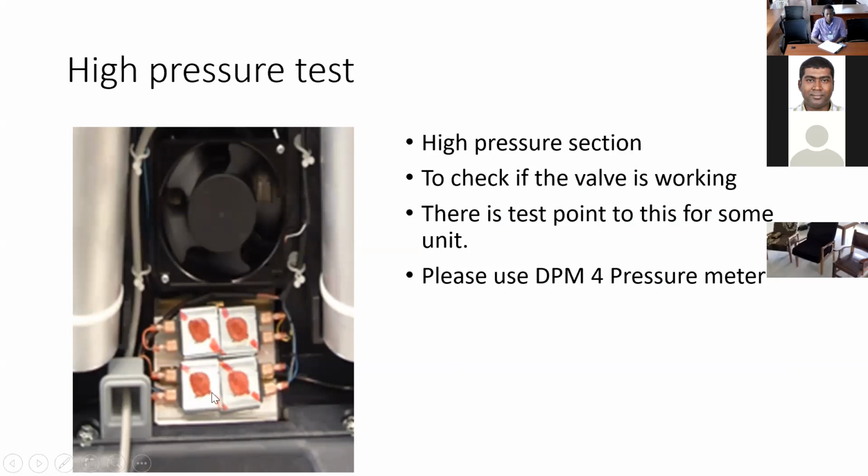These are normally the valves used for high pressure: release air and internal air input. These are valves that control your oxygen to the system. So it sends air to the sieve bed and releases nitrogen through the valve.